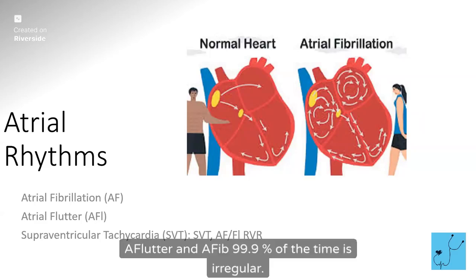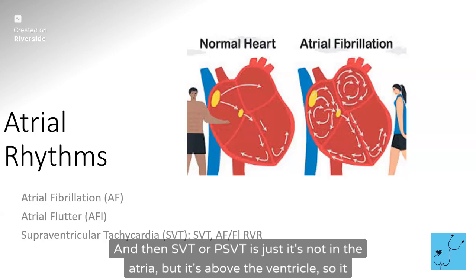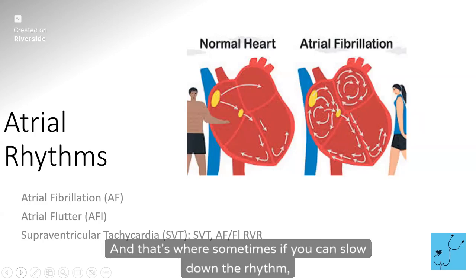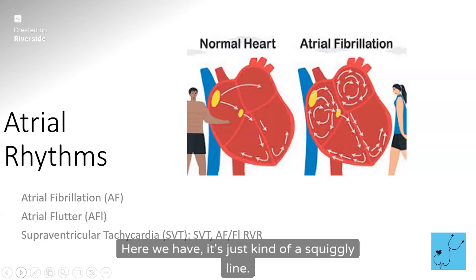A flutter and AFib: AFib is 99.9% of the time irregular. A flutter is almost always regular, and it has those sawtooth P waves. And then SVT or PSVT is not in the atria, but it's above the ventricle. So it still has a narrow QRS, and it is regular. It is not AFib, okay? Sometimes it's hard to tell, is it AFib or is it SVT? And that's where, if you can slow down the rhythm just a little bit, you can see, oh, here we have regular P waves, and here we don't. Here it's just kind of a squiggly line.